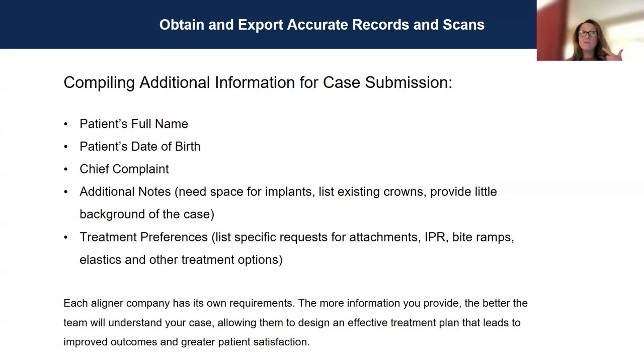But like I said, if it's a molar, you could even stabilize it with a core build-up until then, but to do restorations, especially major ones, like a MODB, your aligner is not going to fit that tooth that you already have made. So then you might have to do almost like a mid-course rescan.